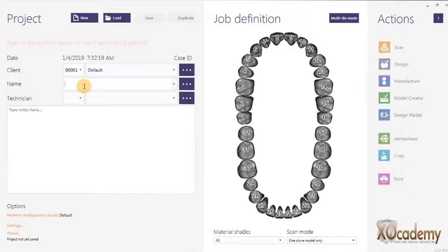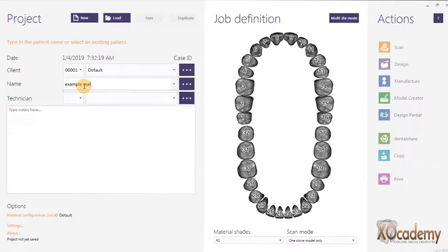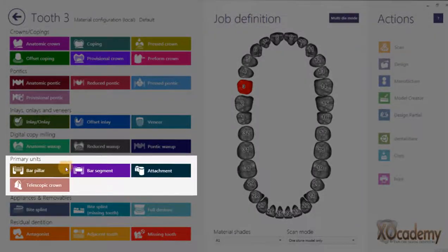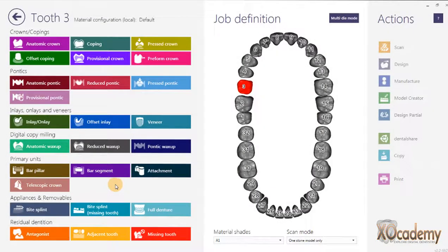An example I'm talking about: let's say we have a patient and we want to make a partial. I click on the tooth, and usually there's a selection here for partial framework if I want to make the framework in the area of tooth number three, but that's not available.